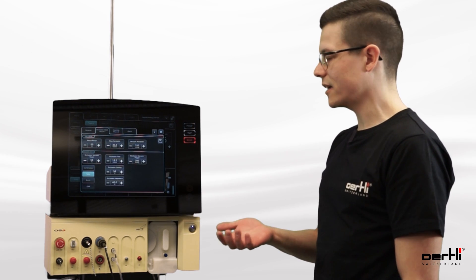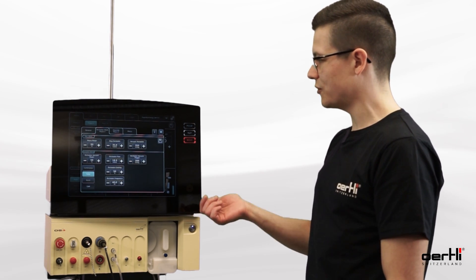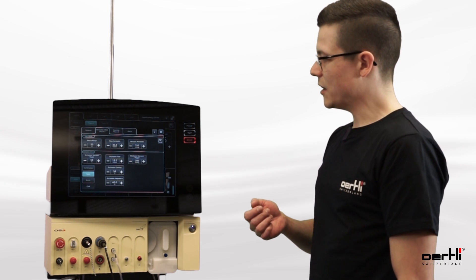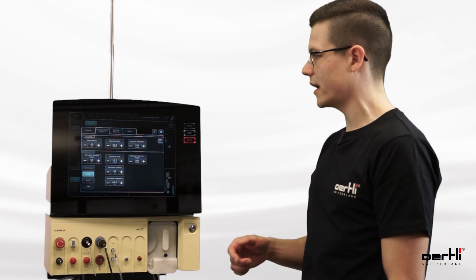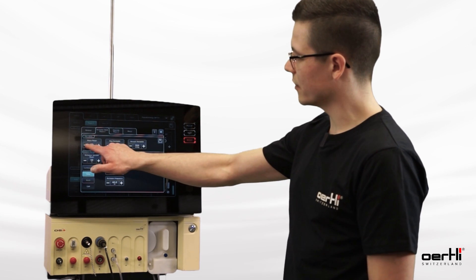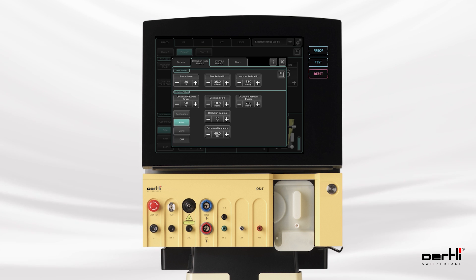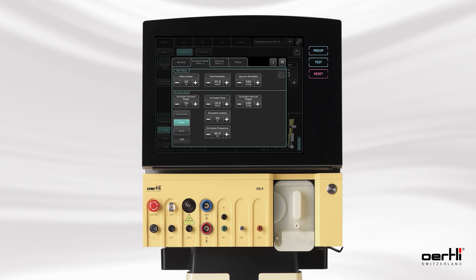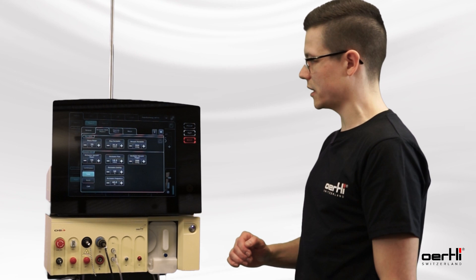The occlusion mode, as mentioned in the intro, is something which should increase the safety and performance of cataract surgery. To increase safety and avoid FACO power being applied into the eye unwanted, we can lower the FACO power for the main values — for example down to 20 percent. I keep it up to 50 percent, so once the occlusion mode gets active I can operate with 50 percent of FACO power. If it's not active, I will stay in the lower power region with 20 percent.